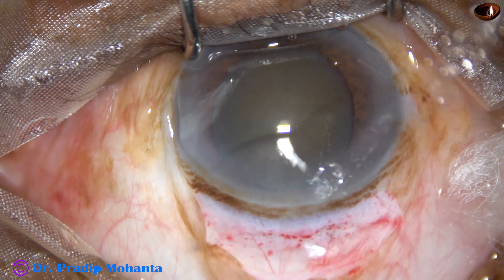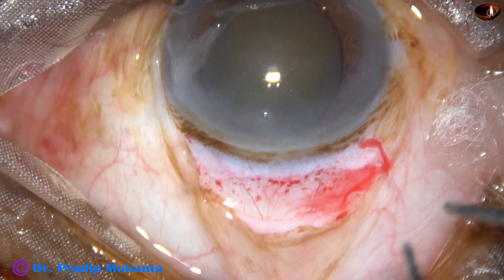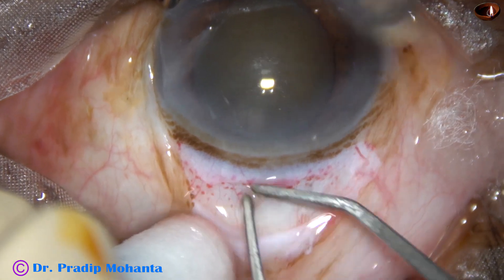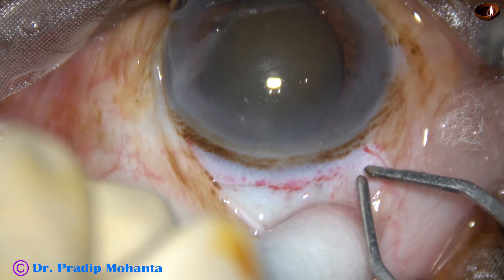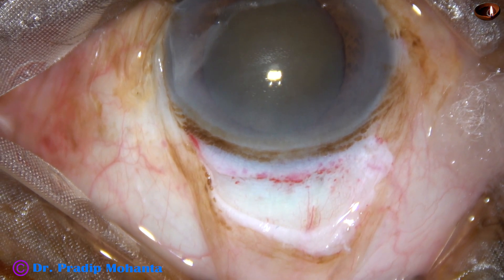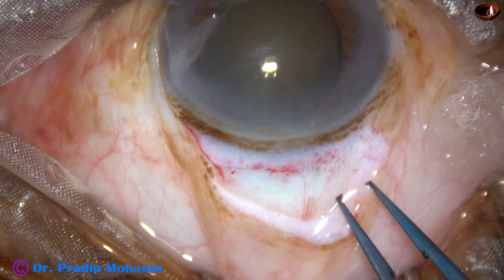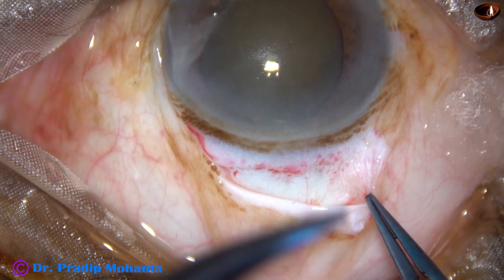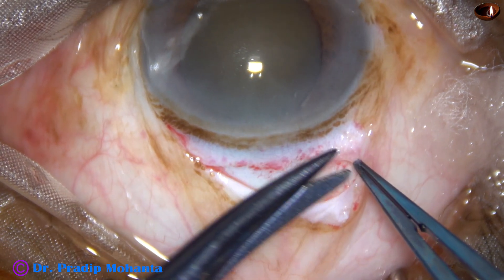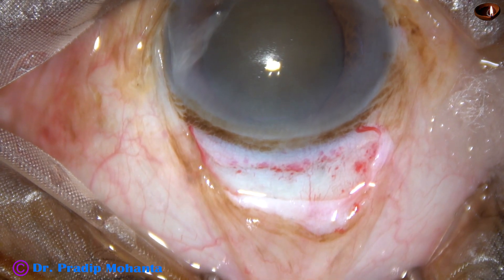Now, wet field cautery is to be done. Very mild cautery is done — the assistant puts drops drop by drop. Do very mild cautery; just a very mild cautery. Don't cause any charring of the sclera. We can see there is some Tenon's on the right side and the sclera is not exposed there, but the sclera is exposed in this area.